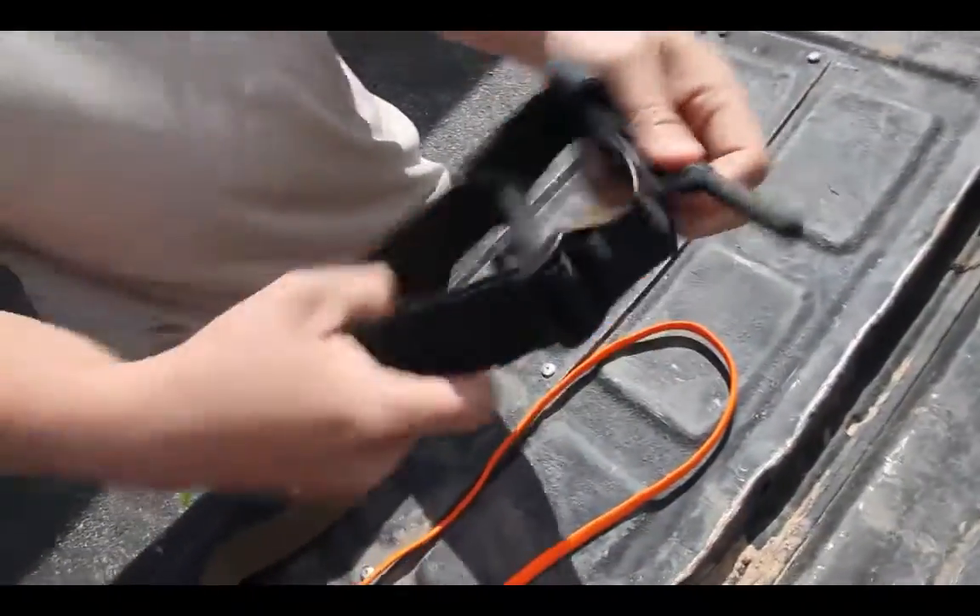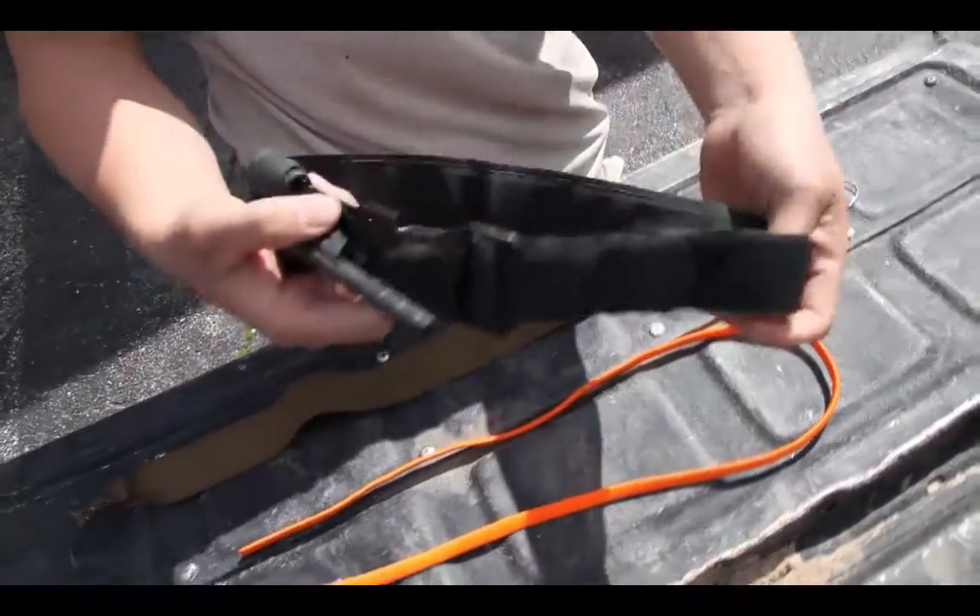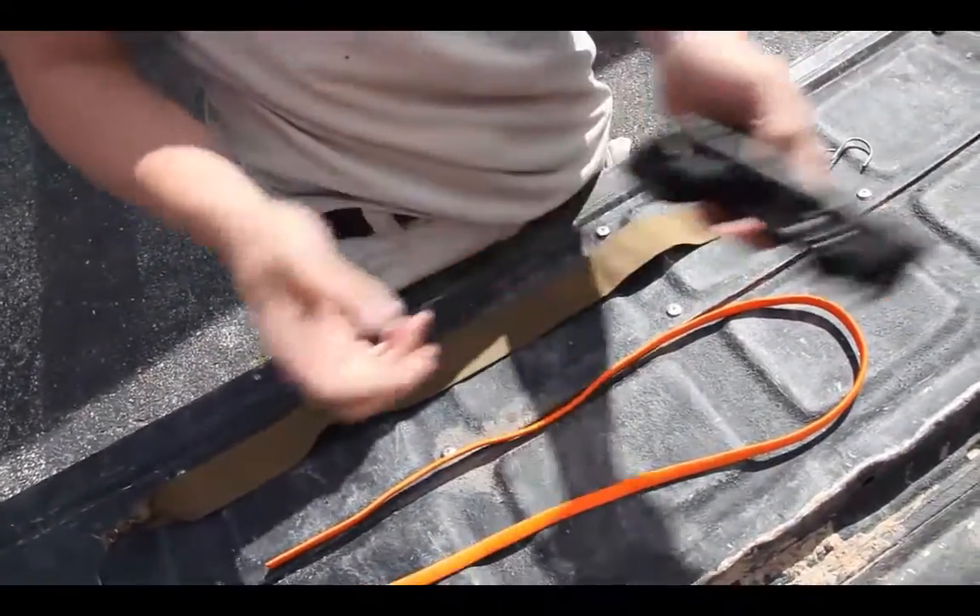That has a windlass. It's a different design, different materials, and a different principle of usage, but the goal is the same — it is to occlude blood flow, or stop blood flow, to an appendage.